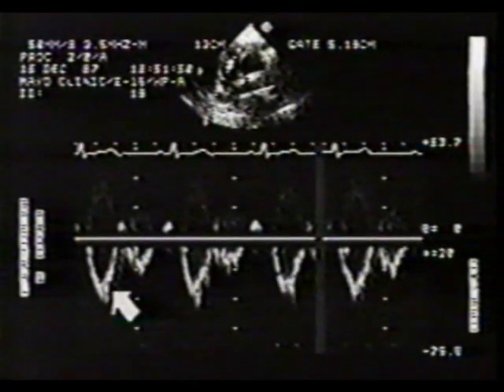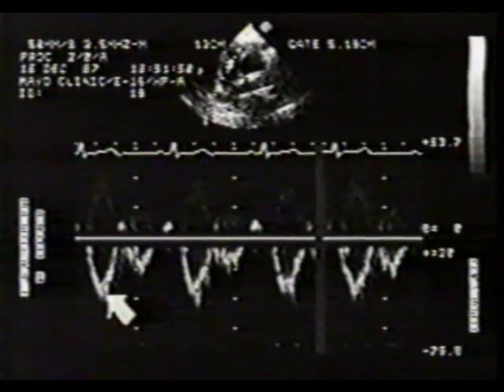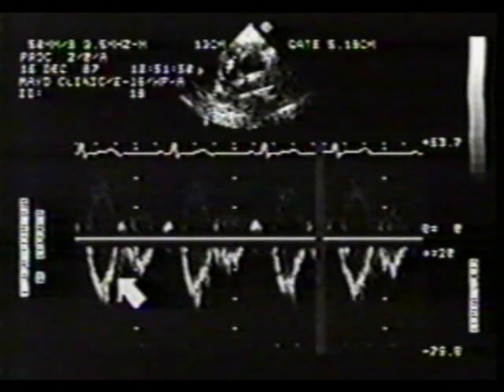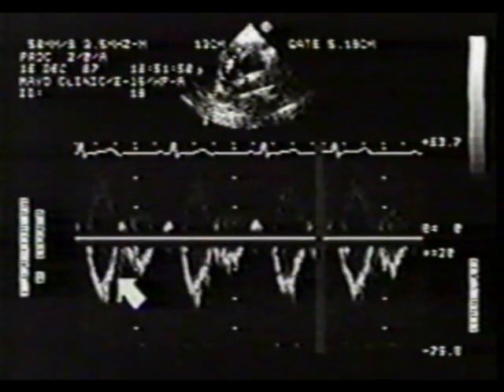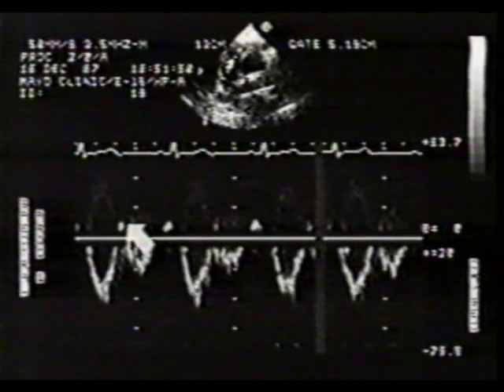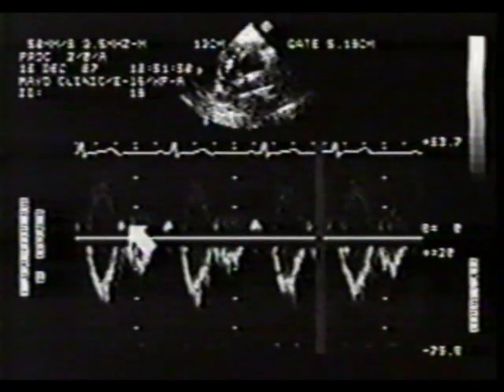There is a systolic wave, which peaks at 0.4 meters per second. This systolic flow toward the right atrium is due to both atrial relaxation and to descent of the tricuspid annulus toward the right ventricular apex. This represents a late systolic reversal of 0.1 meter per second. It correlates with a normal V wave in the jugular venous pulse.